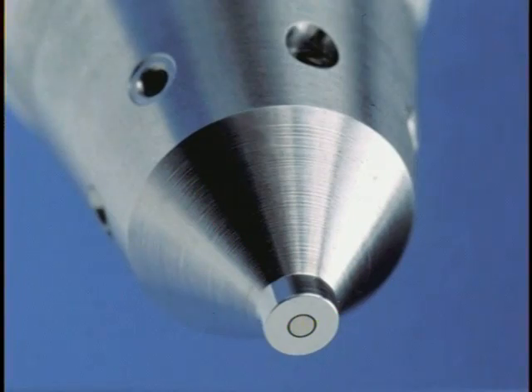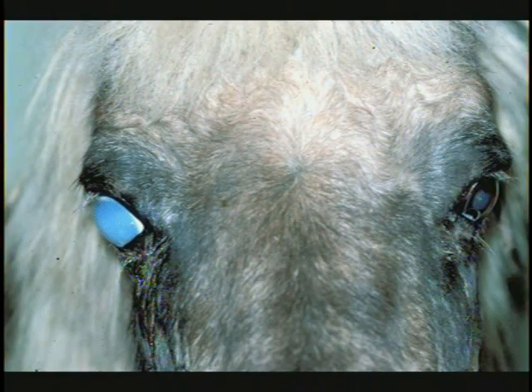In addition, the small footplate allows this tonometer to be used on painful eyes or in less cooperative patients, as only a small area of cornea is required to obtain a reading and the position of the patient's head is not related to obtaining the reading. Finally, this is the only tonometer that is portable enough to allow routine IOP determination in the equine patient.